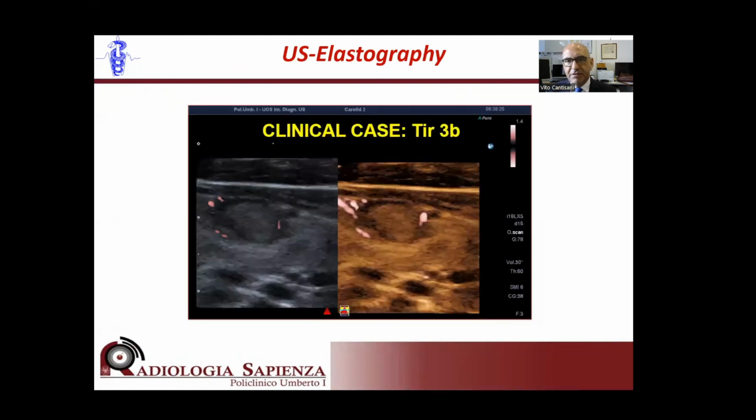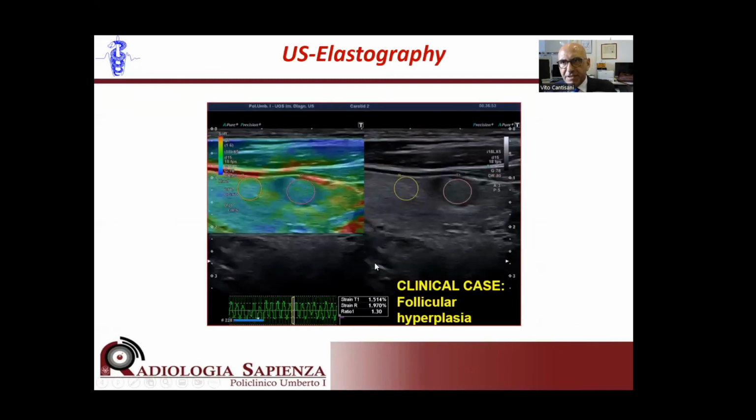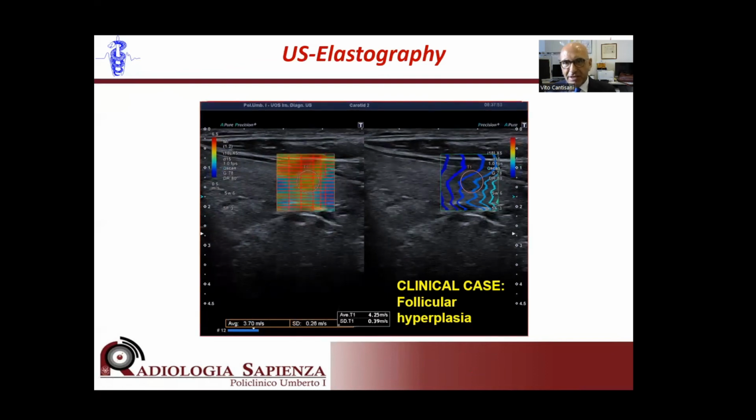I repeated the examination by means of different tools, 3D color Doppler, 3D SMI, and then I put the ROI. I reevaluated by strain elastography, soft, and shear wave with contradictory results. But at the end, this case was proven to be a benign one.